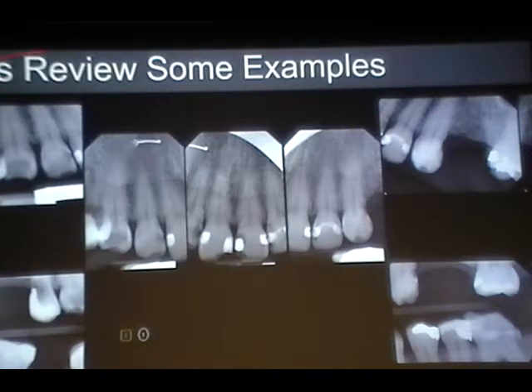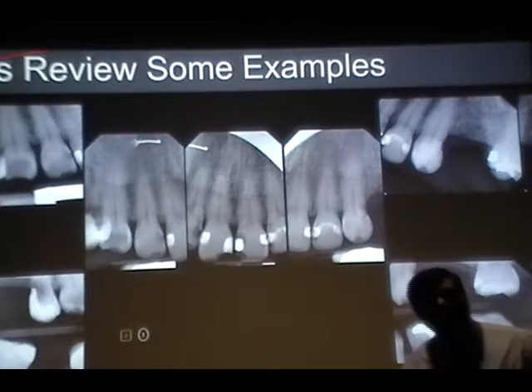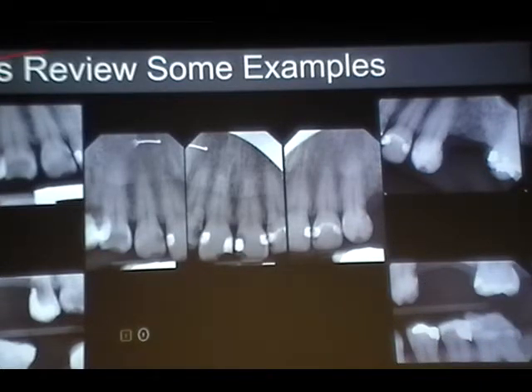I don't know what's wrong with it. Oh my God, you started diagnosing it. Diagnosis comes at a later point. Okay. By the way, I just saw a movie named Are We There Yet sometime last week. So we are not there yet to diagnose. So first we are to just look at the images. Are they good diagnostic images or not? That's all our job.